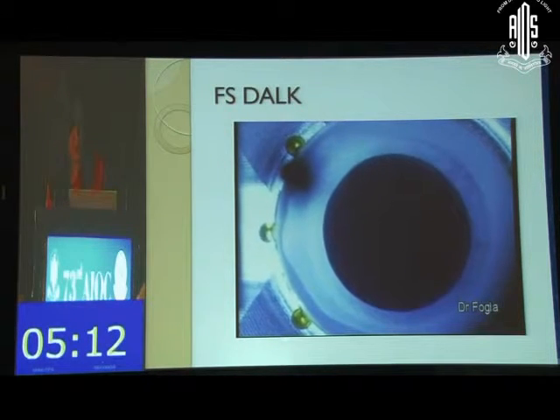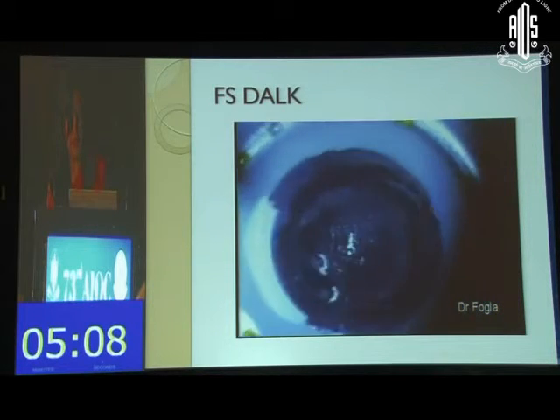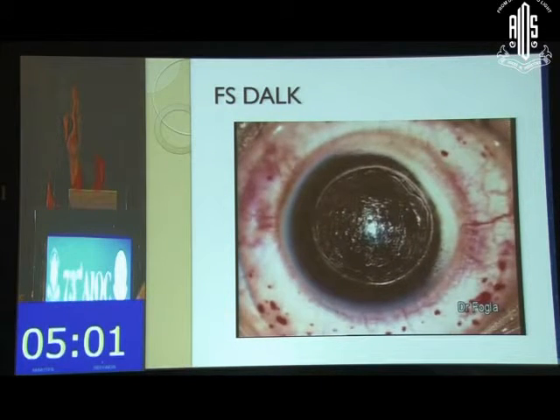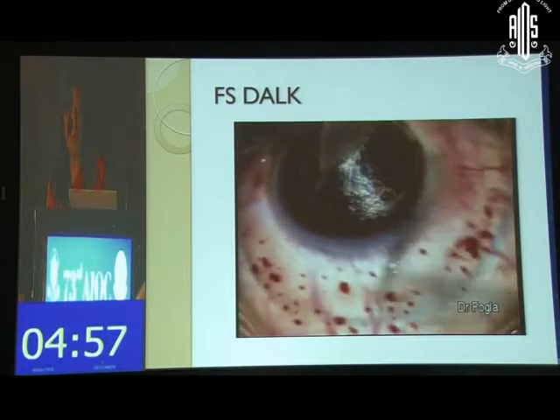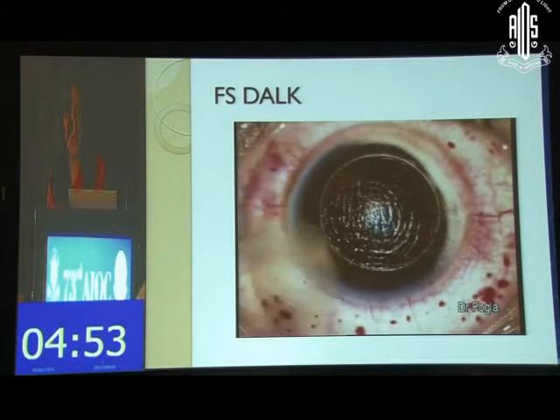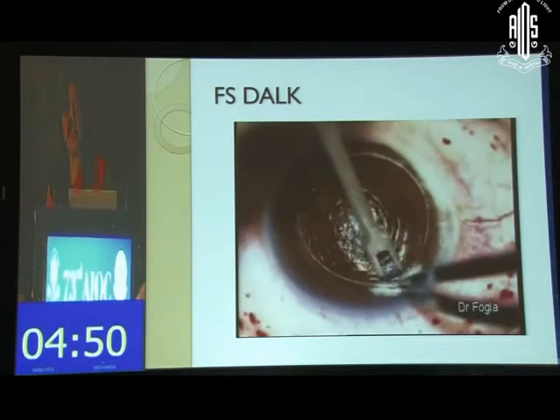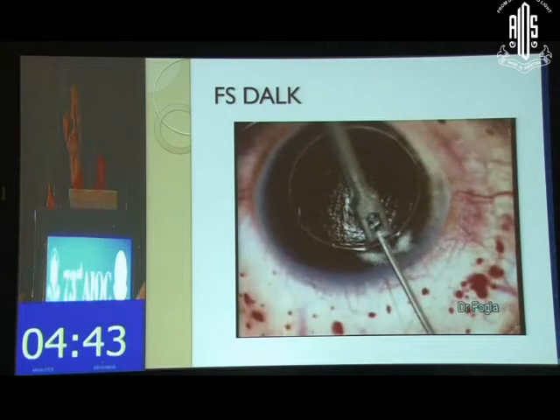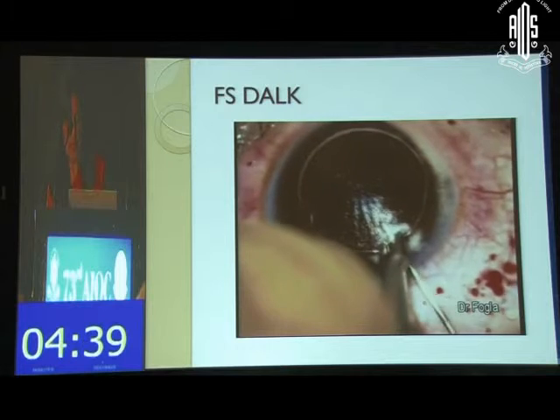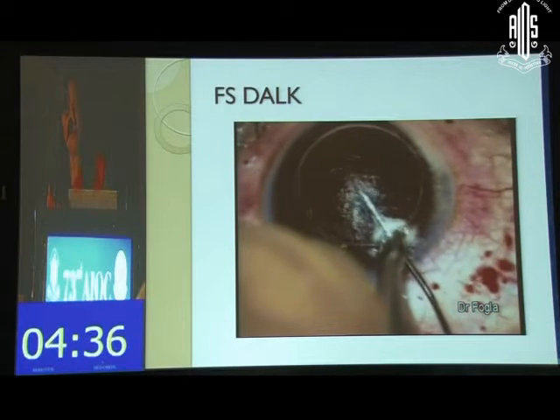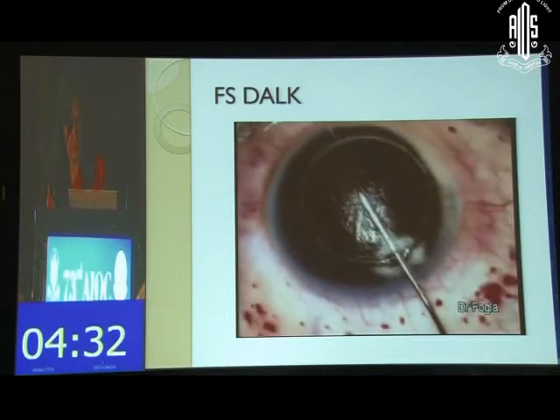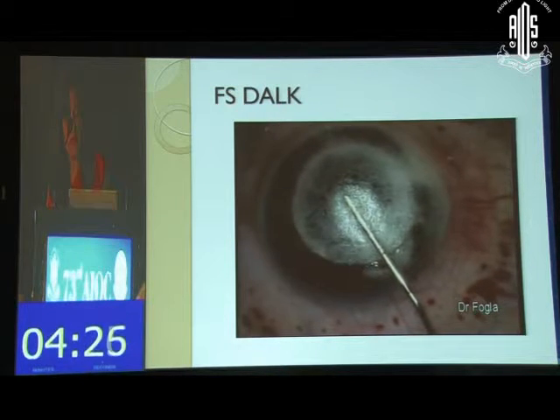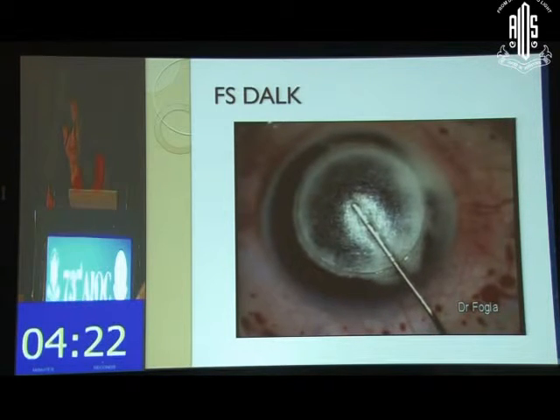This is a movie by Dr. Ajesh Fogla, emailed to me last night. The donor is fashioned first followed by the recipient. The lamellar cut is made with the femtosecond laser, some bridges are present which are removed, and although the channel can also be made with a femtosecond laser, here it is being made mechanically. A dissector is then inserted intrastromally, followed by the big bubble, achieved similarly to a manually done big bubble procedure.